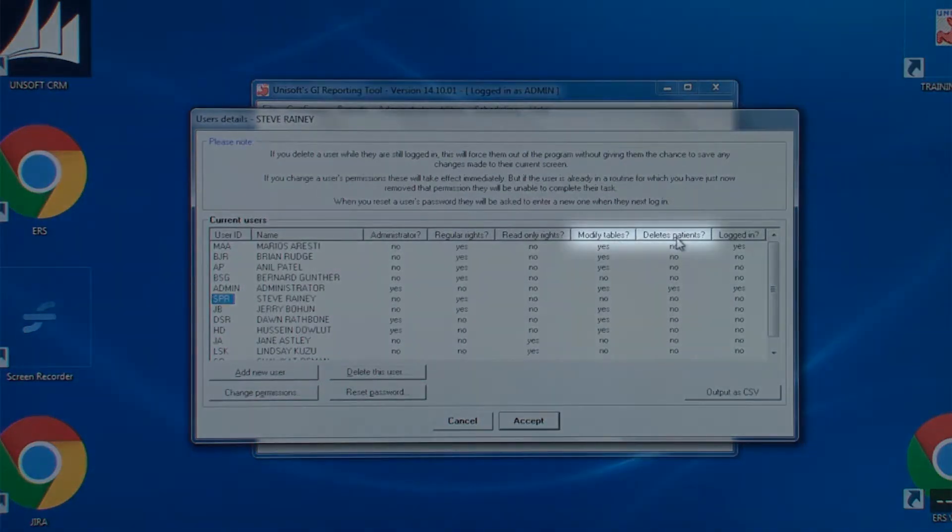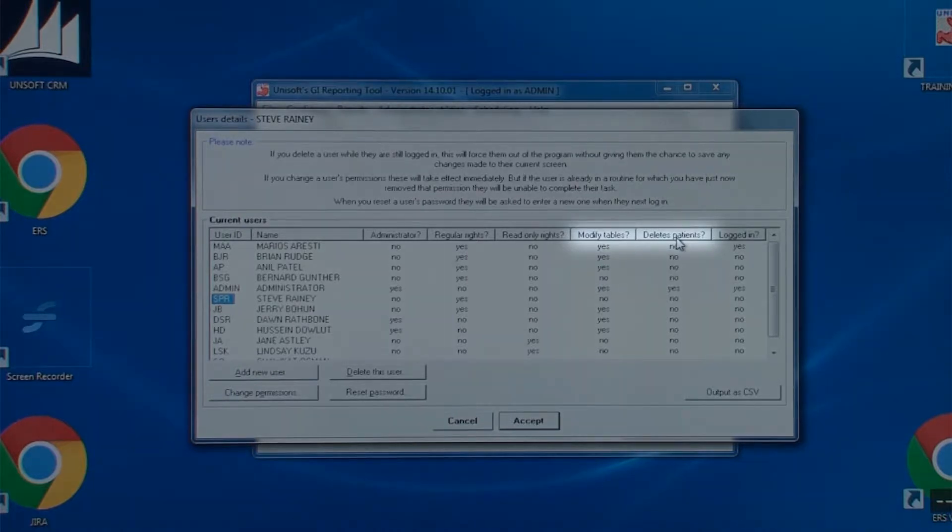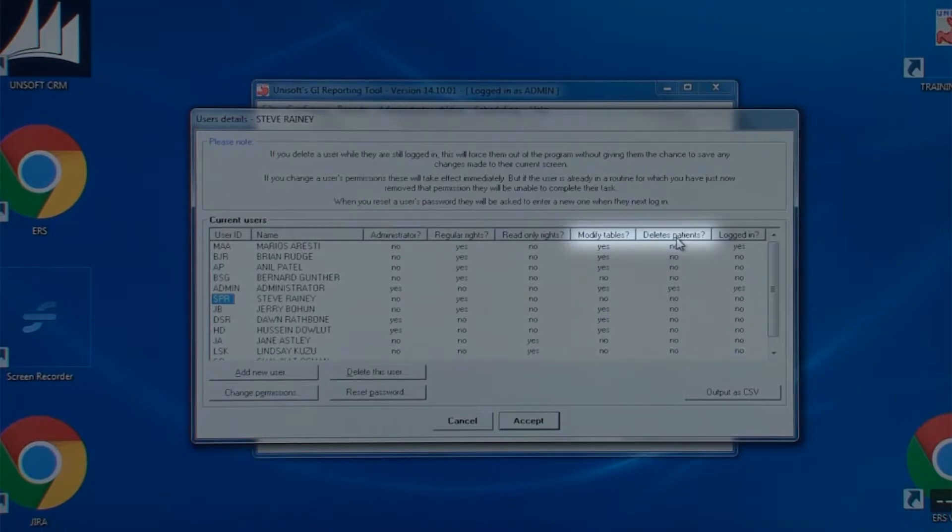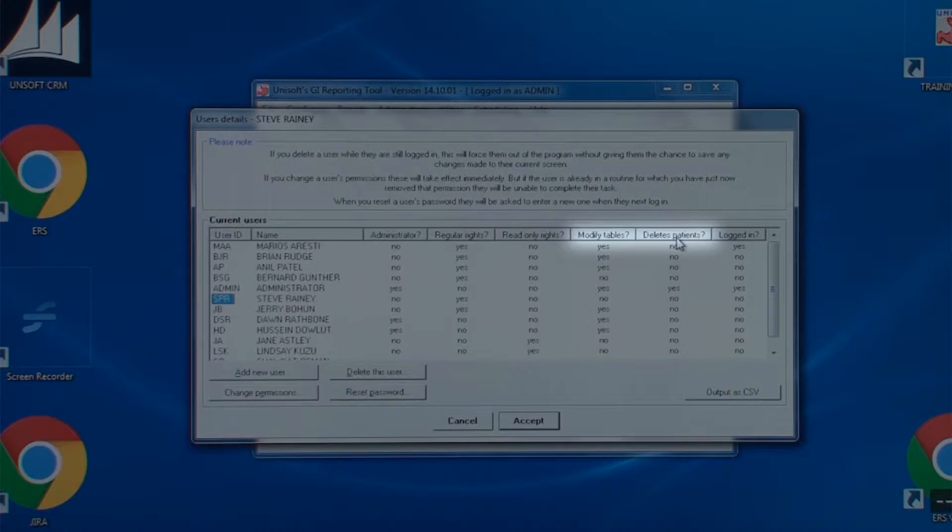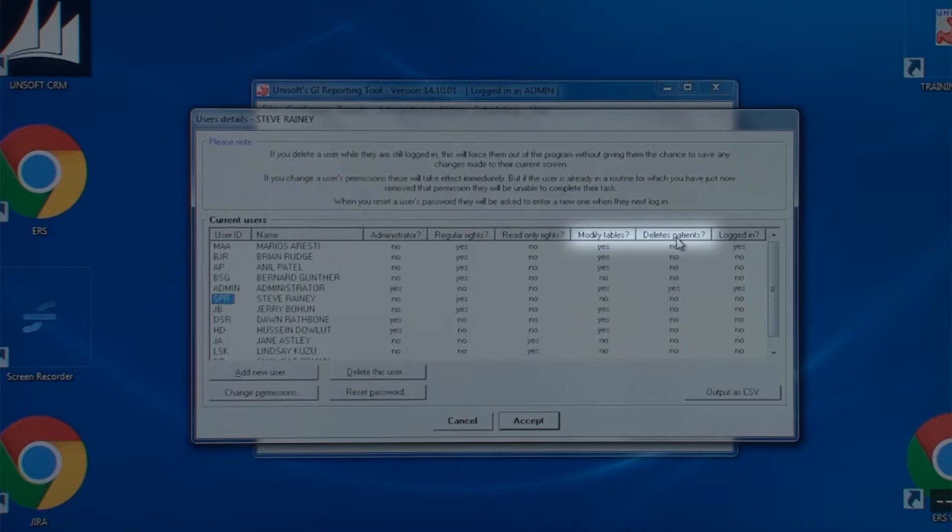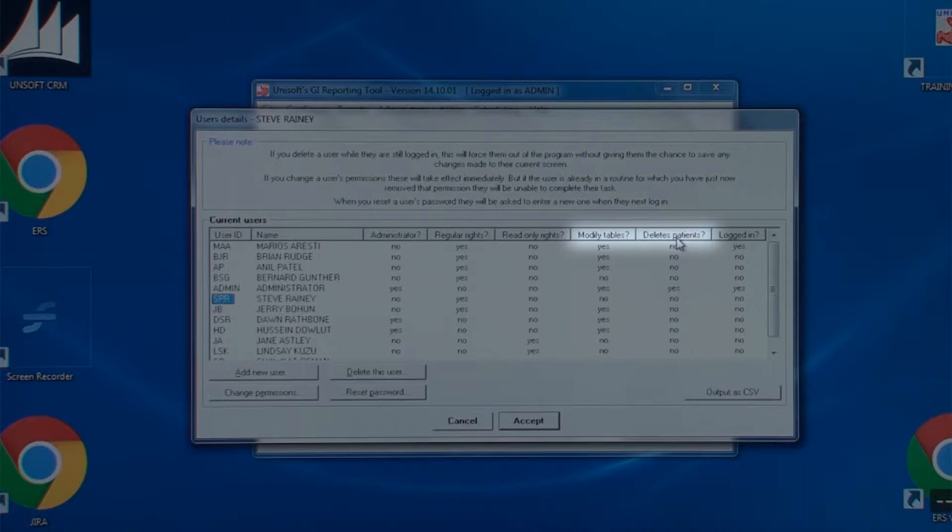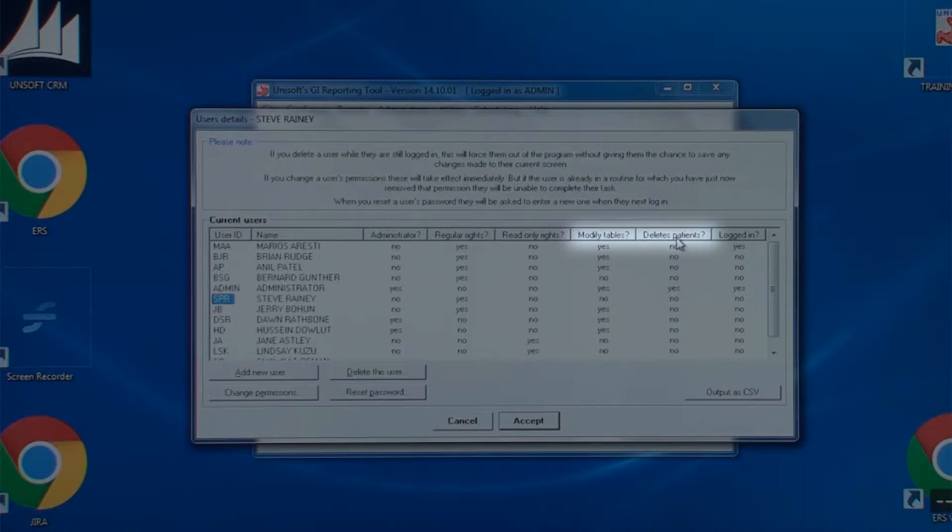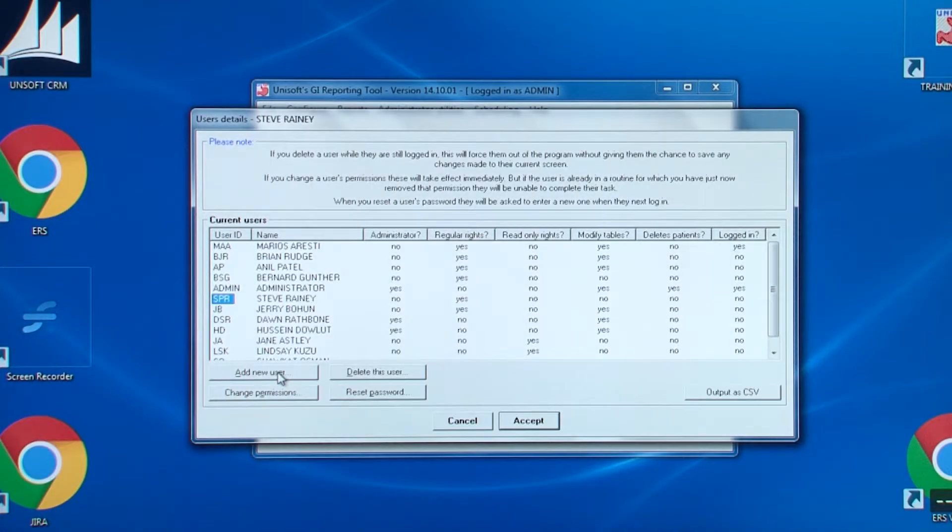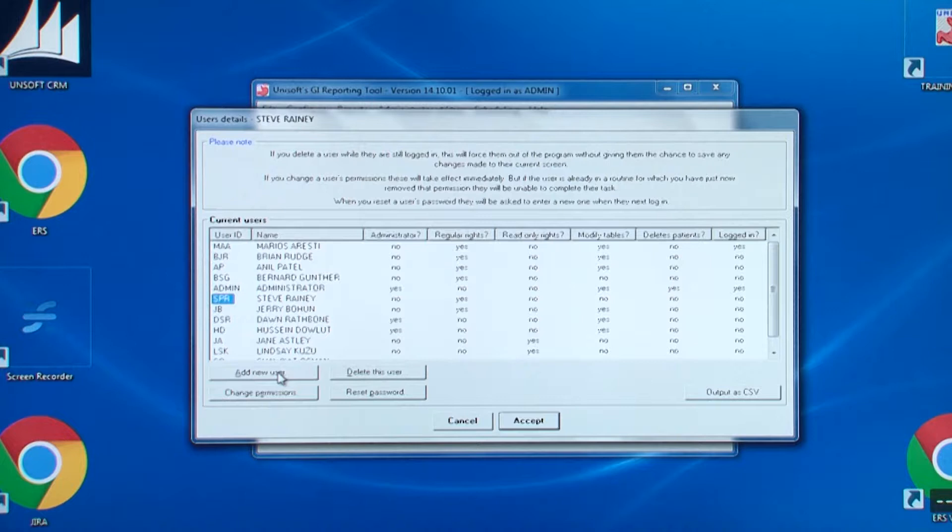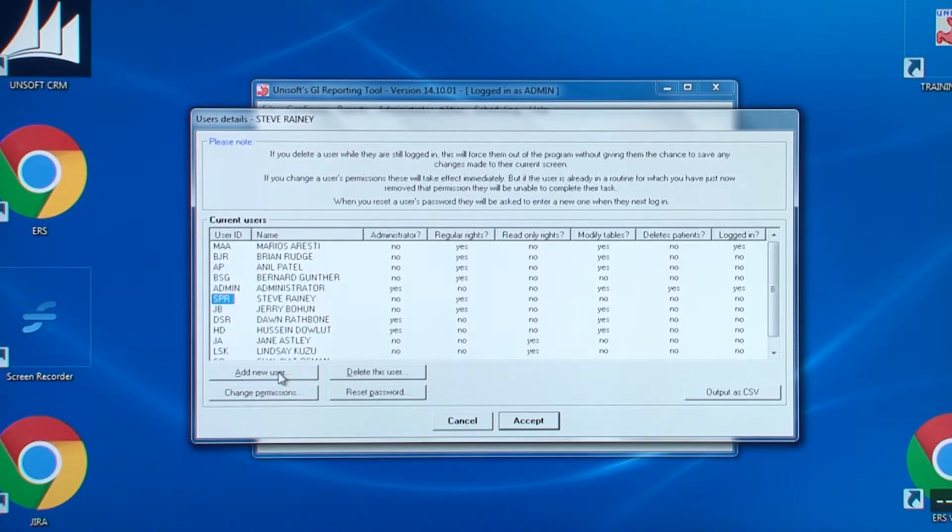Note that there are two further columns: modify tables and delete patients. The first is for those users allowed to add text to the drop-down boxes found throughout the software. If that is a no, the user will only be able to pick entries from the drop-down list. They won't be able to add anything. The second item is important and cannot be changed unless you are logged in as admin. Those who are allowed to delete patients from the database can also delete patient reports. So for security reasons, the only person allowed to change these permissions is admin. No one else can. Finally, the rightmost column shows those currently logged in.